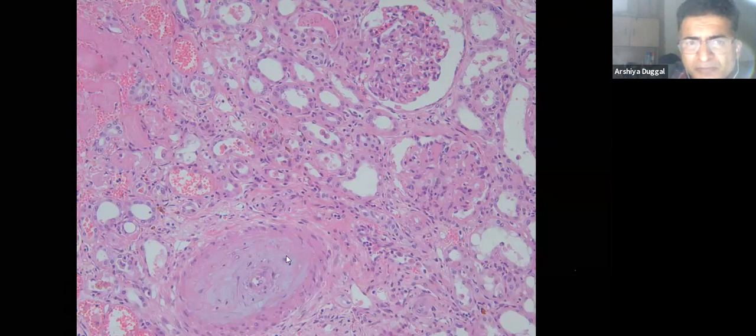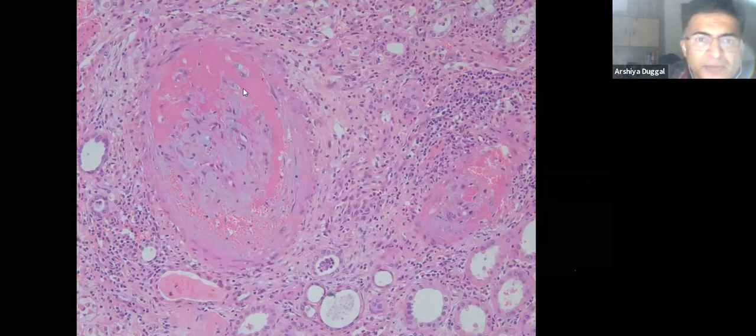The vessels were badly affected, and the glomeruli were showing TMA, and the vessels were showing significant narrowing. You can see this lumen is completely narrowed. This has progressed from acute to chronic AMR because you can see intimal sclerosis now setting in. Another vessel showed necrosis of the vascular endothelium. Similarly, this vessel is also showing complete necrosis of the vascular endothelium. In addition to necrosis, fibrosis has also set in. There are thrombi formed within the vessels, so there is complete occlusion of the vascular lumen.